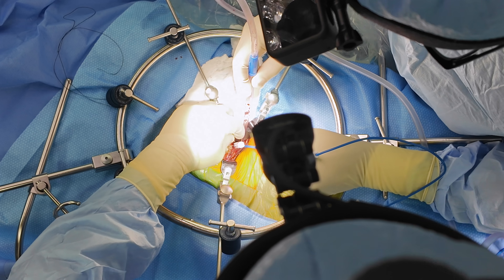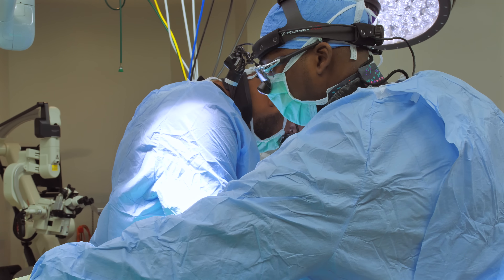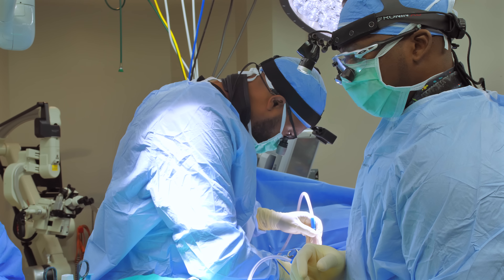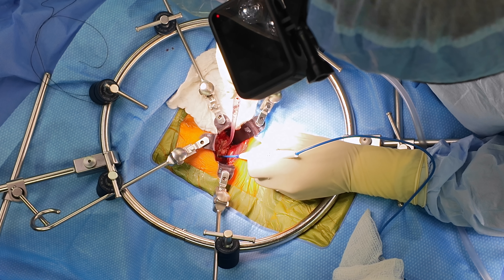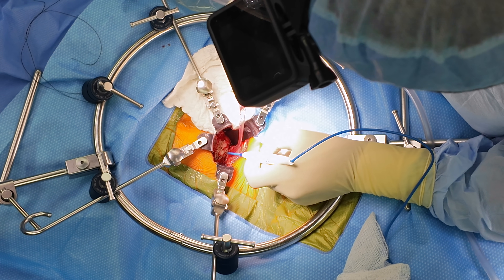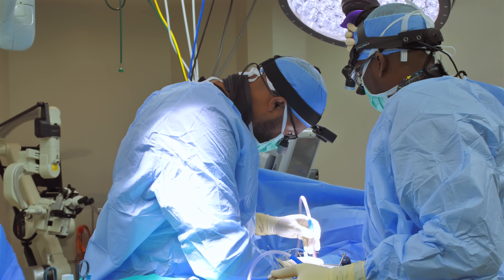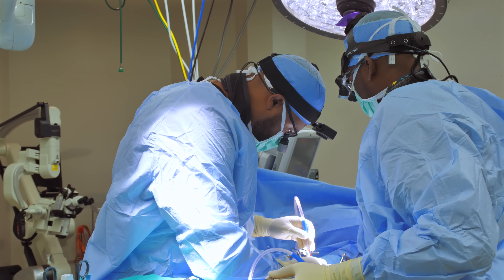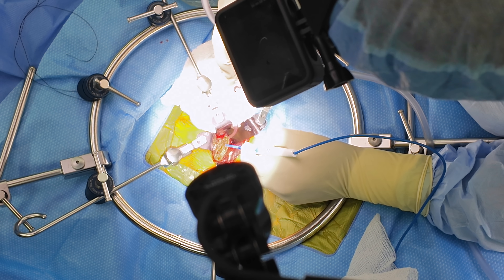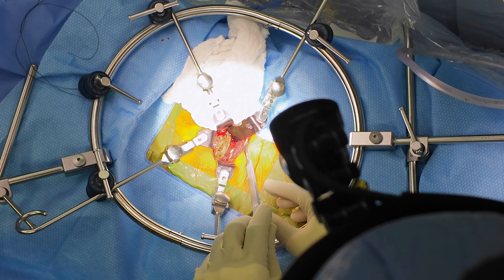We've marked our midline here — we know where the middle of the spine is. We have to put this implant right in the middle. So now we're just doing the discectomy part of the procedure. This is the L5 vertebral body here, and this is the S1. I'm just marking it out with my bovie here. I have my partner Darcy John Way — she's a spine surgeon also. Her level is really collapsed down, so I'm just marking out where we're going to do the discectomy.